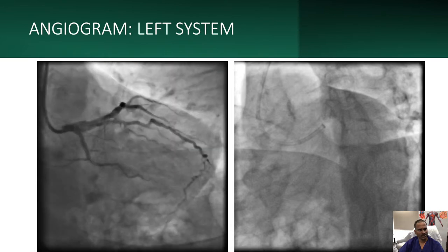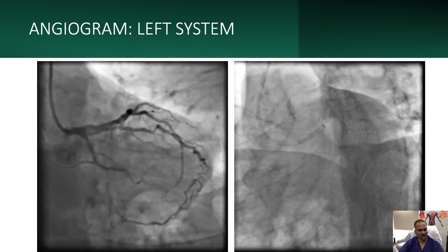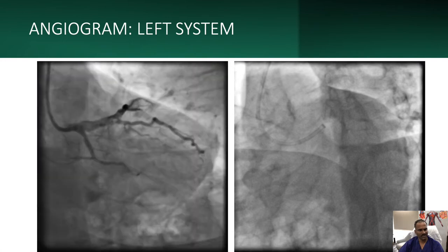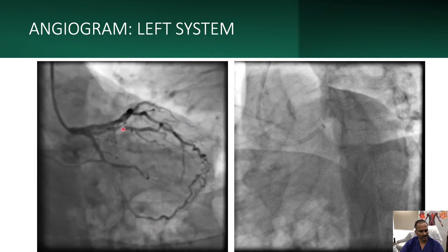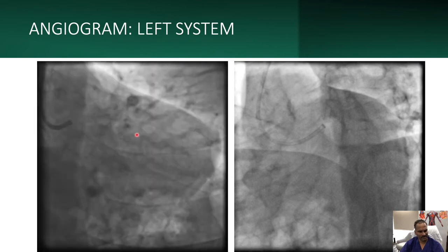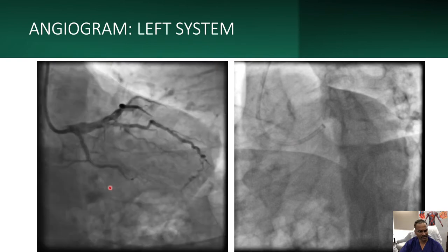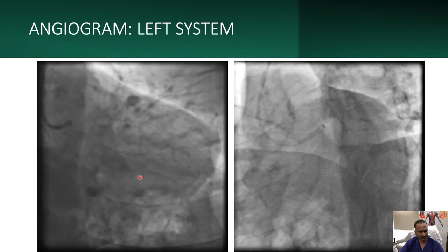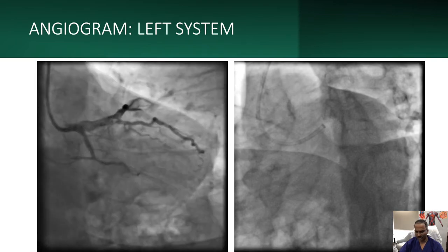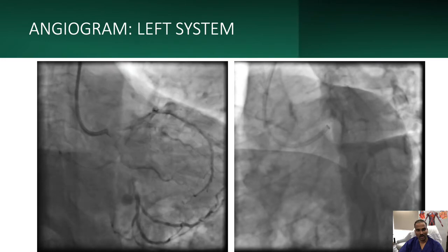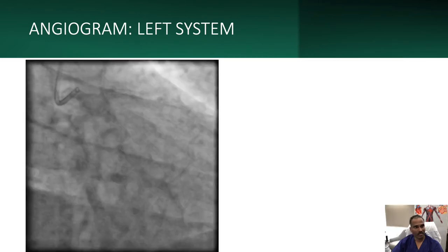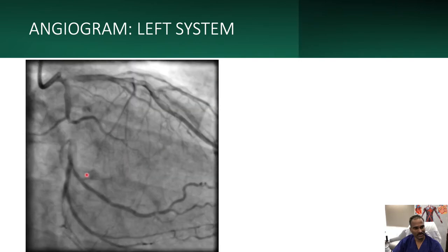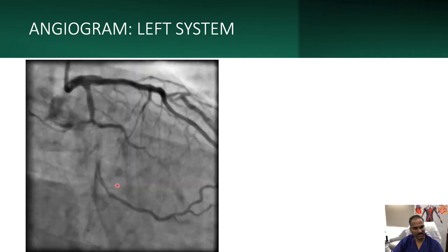This is the angiogram of the left system during the last attempted CTO PCI. You can see a patent stent in LAD and patent stent in Ramus, but there is disease in the mid-stent in Ramus and there is a total occlusion in LCX without a clear proximal cap location. The same is seen here in a low caudal view. The distal vessel is quite good and it's a big territory — in fact, it is a left dominant system.